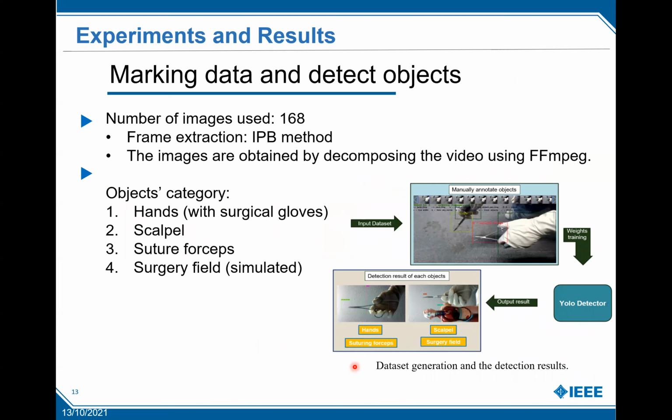So when talking about the detector, YOLOv4 is a new version algorithm, and there has been almost no research about surgical detection based on it before. So we designed this experiment to test its effect in recognizing several objects in the surgical scene.